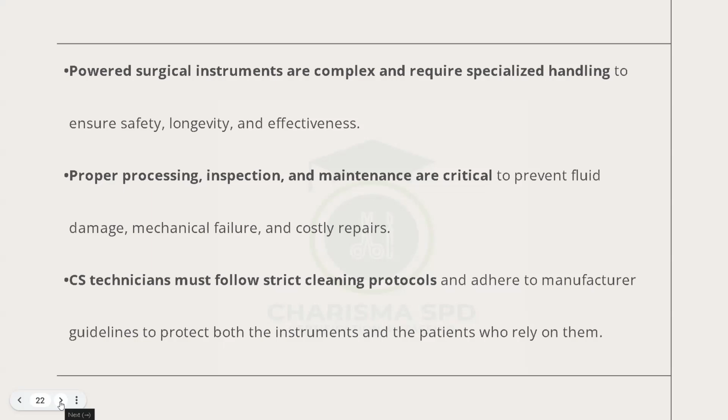Same thing, you must not allow liquid or fluid to invade the system. It will damage it. It won't work. And everybody will be panicking when the surgeon is upset in the room. So make sure that you don't soak it and go for lunch, or soak it and leave it unattended.